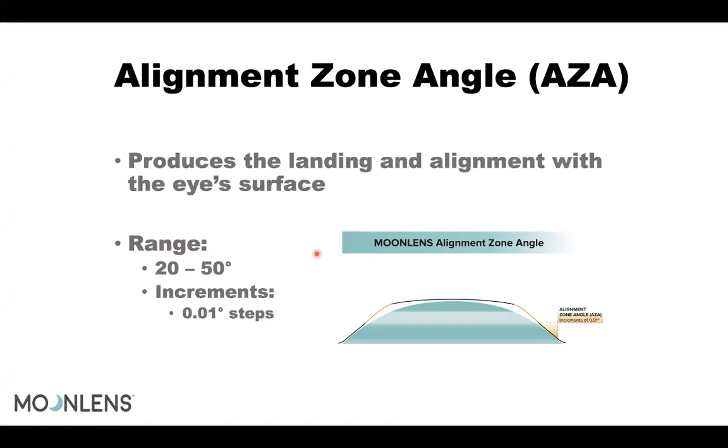And as Randy has mentioned in many webinars, a 30 microns difference between the two meridians, the horizontal and the vertical, or the steep and the flattest meridian, is going to determine whether we should go to a toric lens or a symmetric lens.